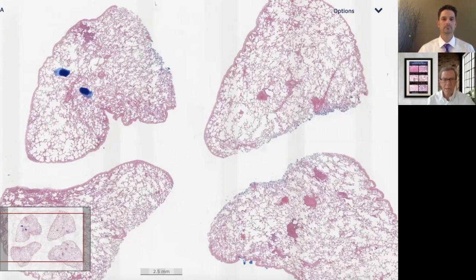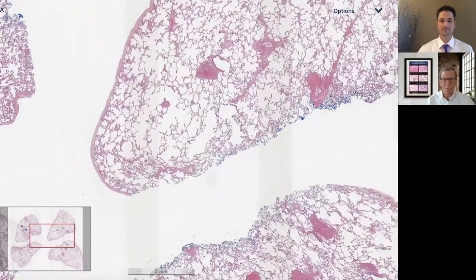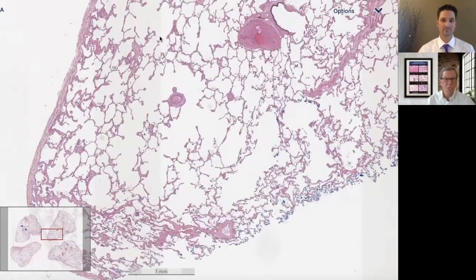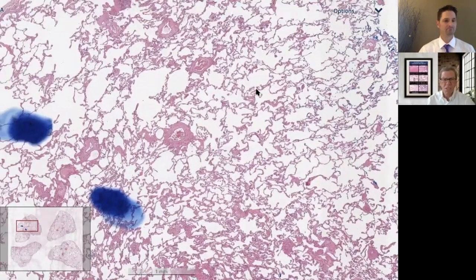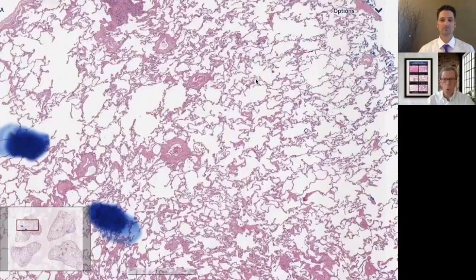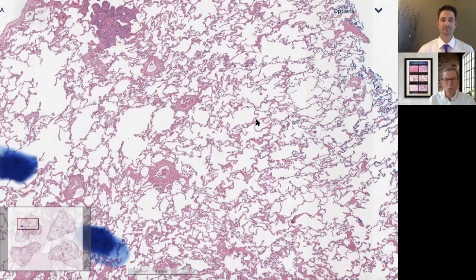This is the kind of case where we're looking at the biopsy and those who've joined us are asking themselves: this lung tissue looks fairly well aerated, I see a lot of air spaces, I'm seeing some small pink nodules and some places that look a little reticular with some interstitial thickening, but this doesn't look like an NSIP or a cellular interstitial pneumonia, or an organizing pneumonia that might produce ground glass. So I'm perplexed, as I think most pathologists would be, looking at this case at low magnification.